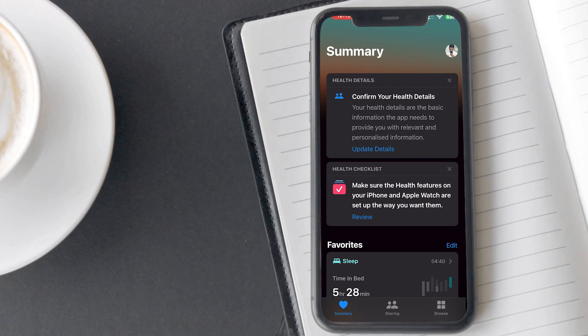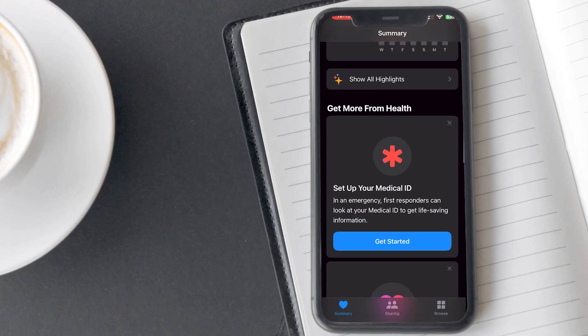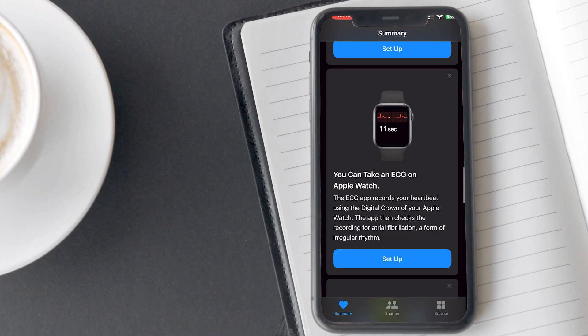Open the Health app on your iPhone. You will see the summary tab by default. Scroll down until you see the ECG setup card. Here it says 'Take your ECG on Apple Watch' and how you can record atrial fibrillation with the help of the crown button.